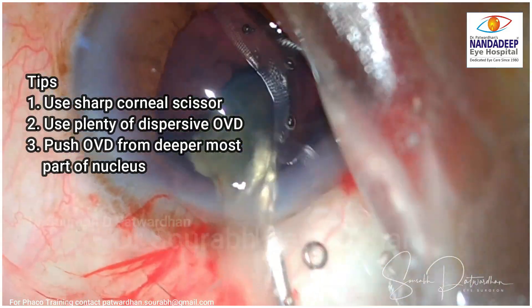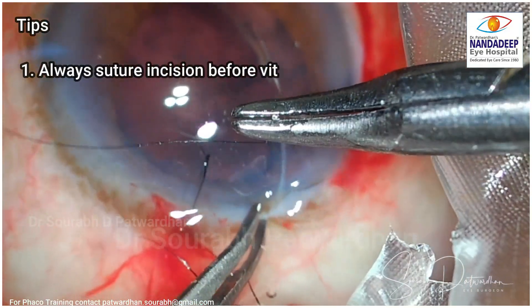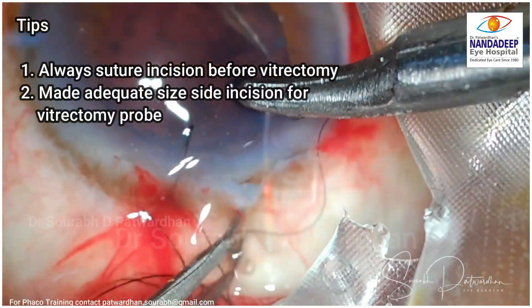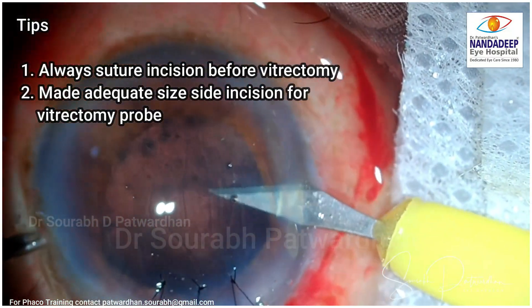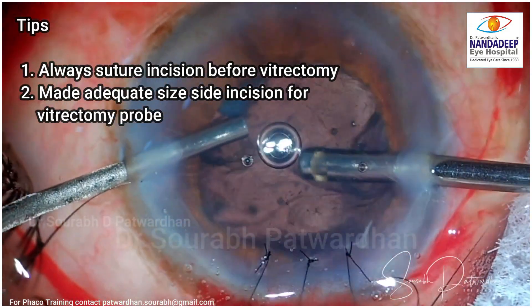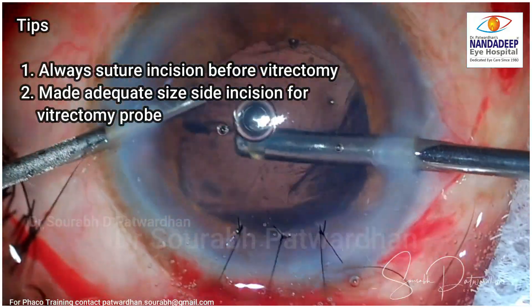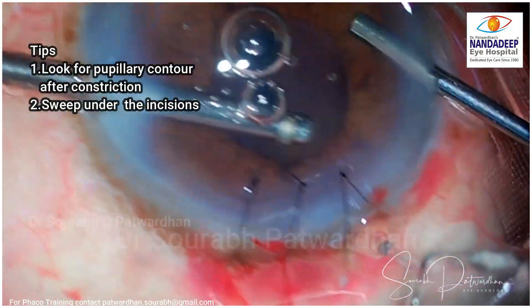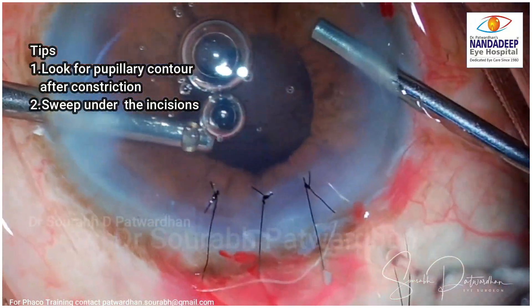Make sure that OVD is pushed from the deepest part — that means you have to go behind the nucleus pieces and then push the OVD. Always suture the incision before you start with vitrectomy so you have a closed chamber, because with a corneal incision it is more likely to leak than with a scleral incision. Make sure that the pupillary contour is round and there are no vitreous strands going into the incision before you finish the case.